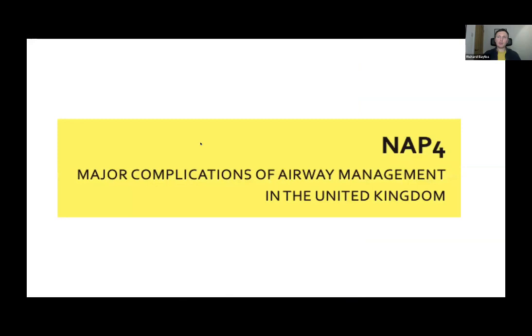And NAP4 was a real sea change in the way that we approached airway management in the UK. So this is a national audit project of the Royal College of Anaesthetists, looking at complications of airway management in anaesthesia. So that's elective and emergency anaesthesia, but in anaesthesia in the UK.